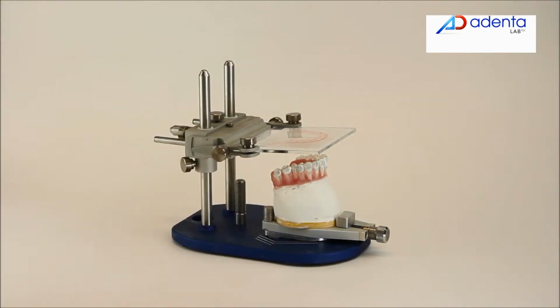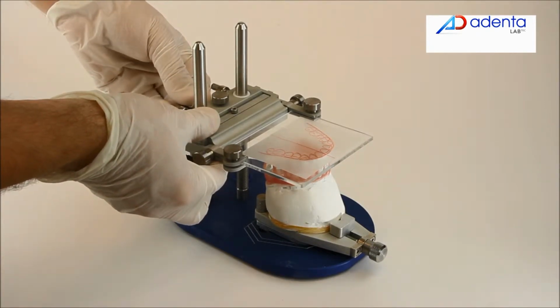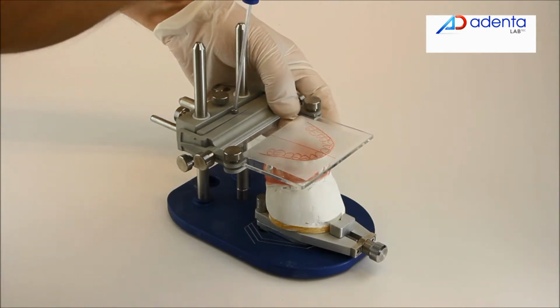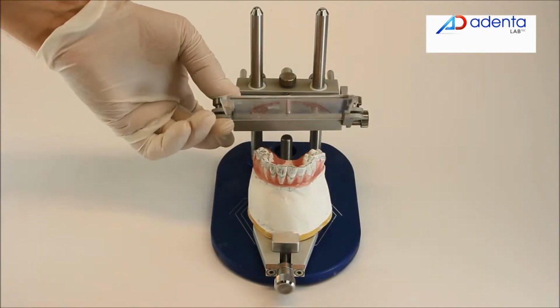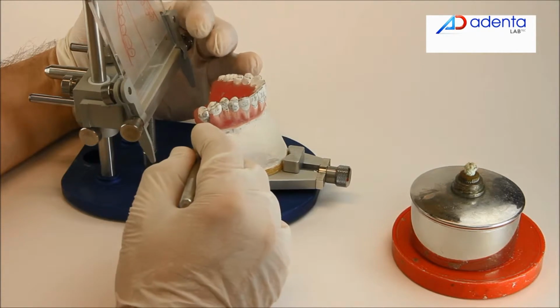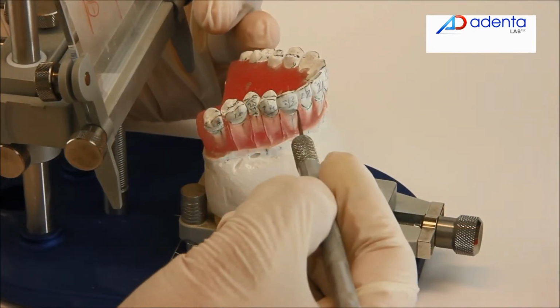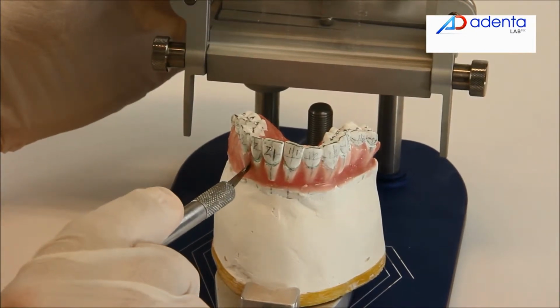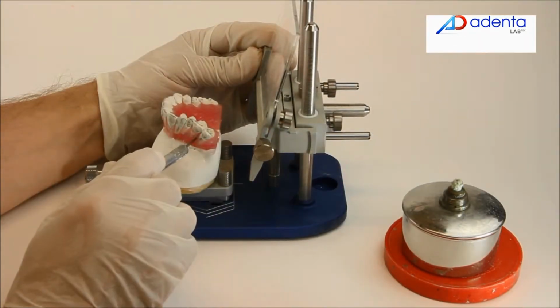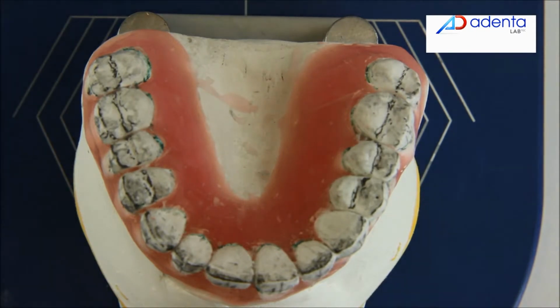Use the screws to adjust the height, the sagittal movement, the canting, and the rotation. Carry out the correction. Warm up the wax in the same way as you have done with the lower model. The acrylic plate allows you to keep all the characteristics and the position of the occlusal plane.